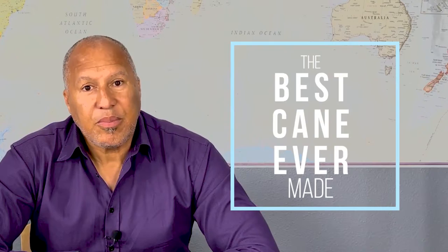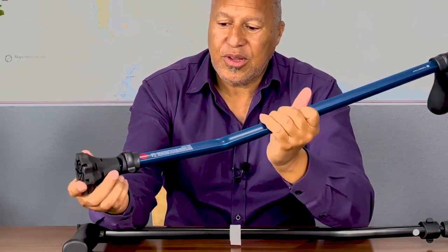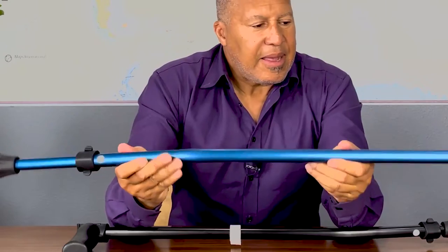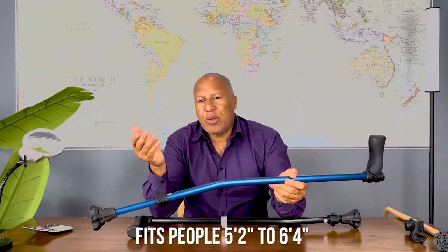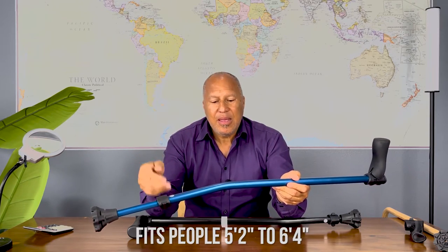My friends, the doctors and physicians who have looked at this device all believe it's the best cane ever made. With any cane, there are two really important points: the part you hold and the part on the ground. In between, you want the cane to be properly adjustable. The cyclone cane fits someone anywhere between about five-two to six-four, depending on your arm, leg, and hip length.